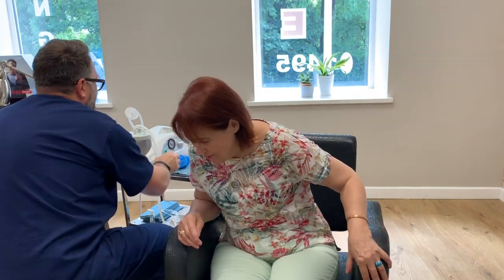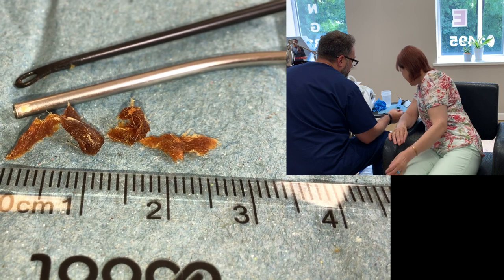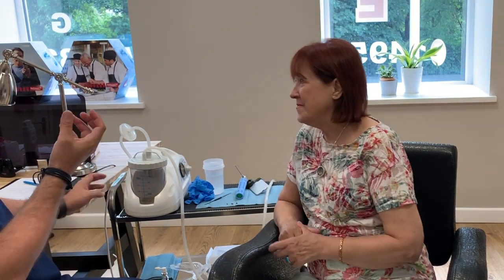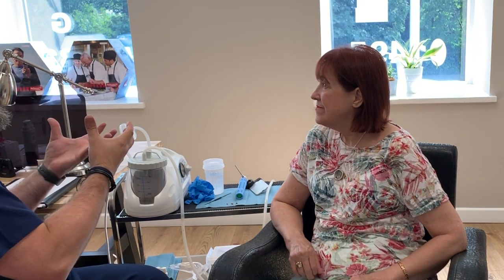Do you feel all right? It's achy a little bit now, but it's been clogged for such a while. That's right — it's going to feel a little bit strange, yes. And where that wax was very sticky, it was all stuck to the canal wall. So when we take that away, all the skin underneath needs time to dry out a little bit — it's probably a bit wet. But it looks really healthy; skin looks good, eardrums look perfect both sides. These are the little pieces — really kind of sticky. When it starts to get that kind of deeper brown colour, it gets really sticky and that's what causes the problems. It had migrated down the canal and done really well to get that far, but it had just dried as it got to the entrance of the canal, stuck to the canal walls, and that's what was causing the problems.